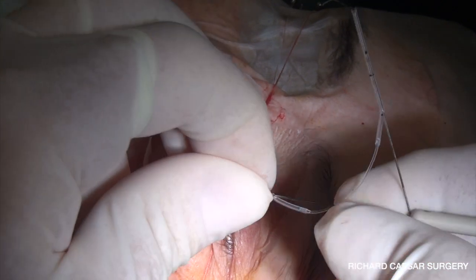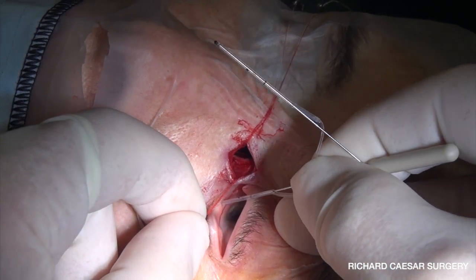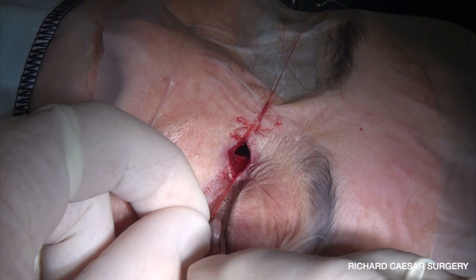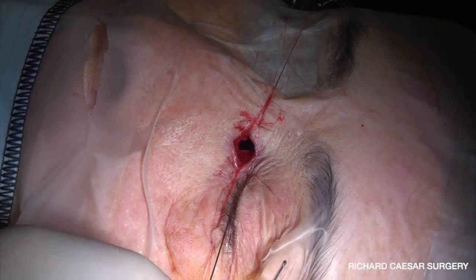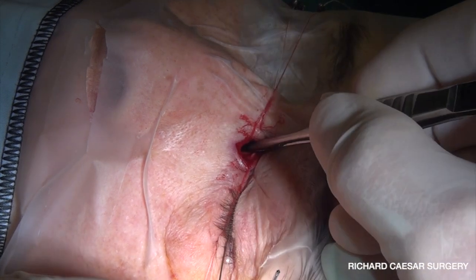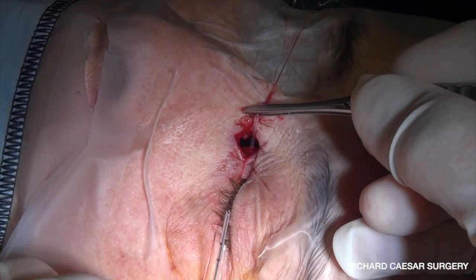Inserting it is very straightforward once the punctum is dilated. Just like you would with any silicon, you pop in through the punctum vertically, hold the lid nicely on stretch, and then pass along the canaliculus into the nasal space where the tip should appear nicely in between your pre-prepared lacrimal sac flaps. You can see it just there — I'm holding the tip with the Moorfields, pulling out the probe, and there's the silicon passed. Couldn't be easier really.